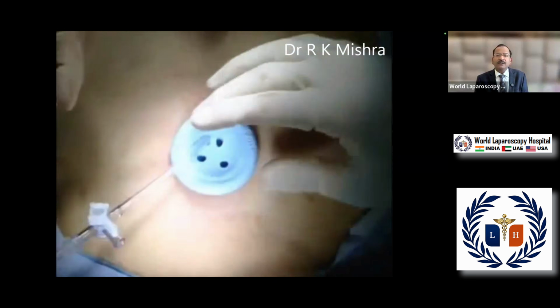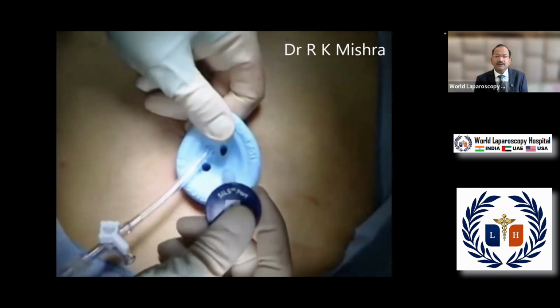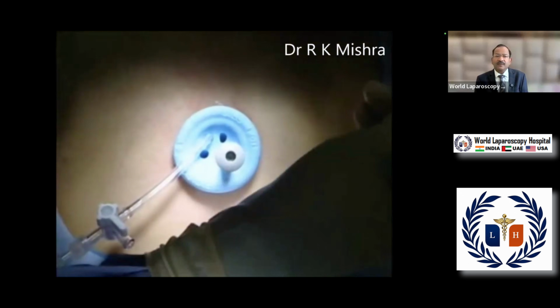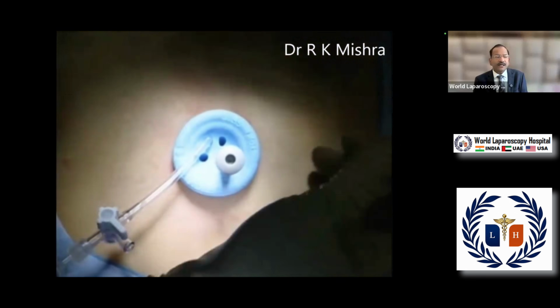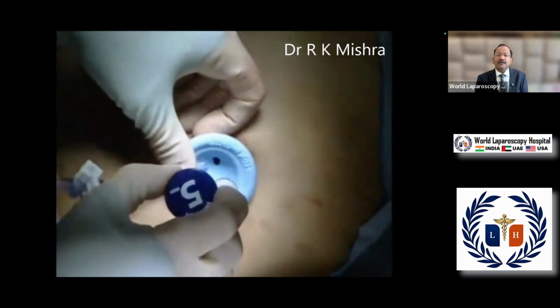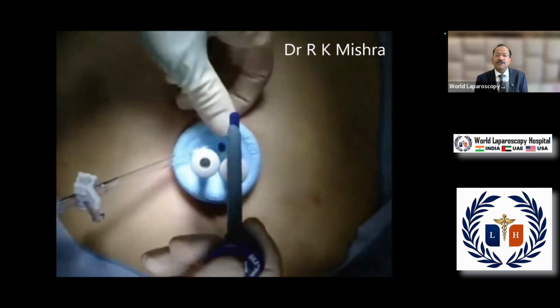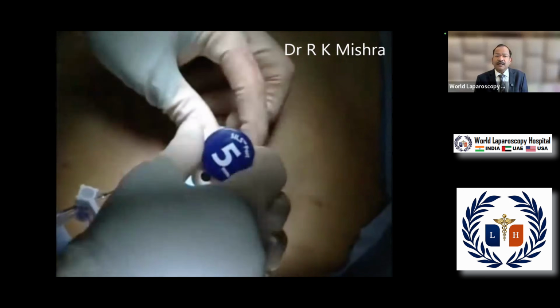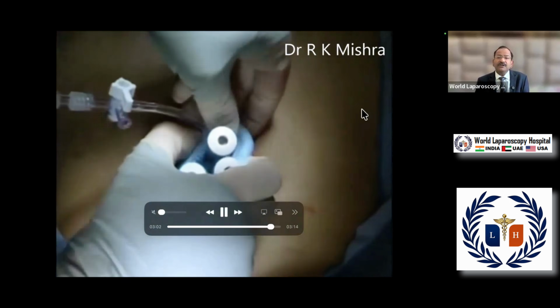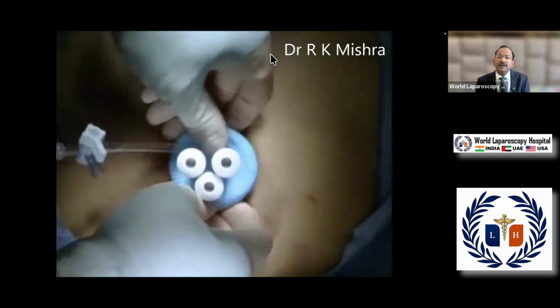And then put the other ports, like this. And at 6 o'clock will be the telescope, and 10 and 2 o'clock will be the two instruments. And then you start doing surgery. And at the end, once you remove the port, your scar won't be visible. Your scar will hide.